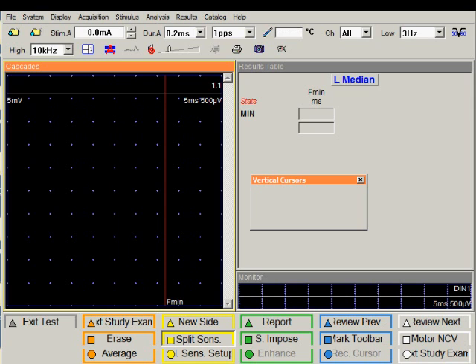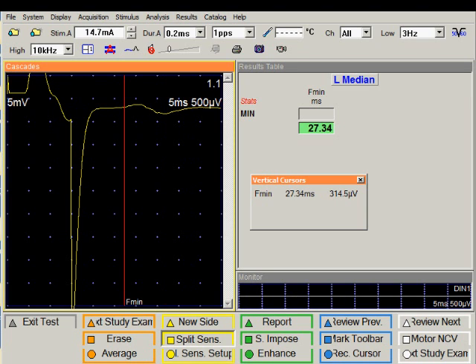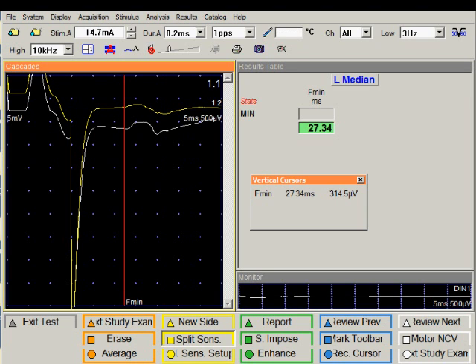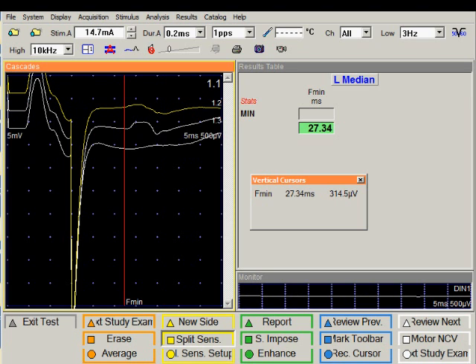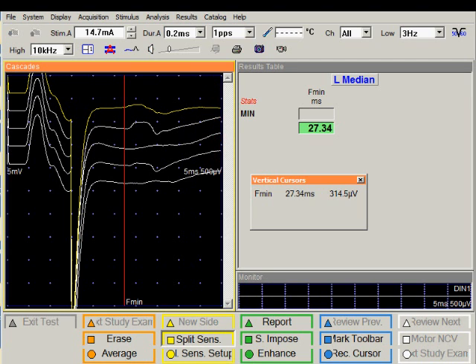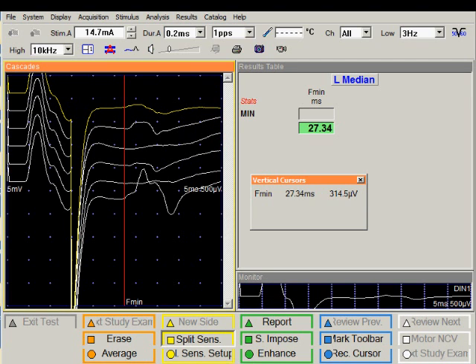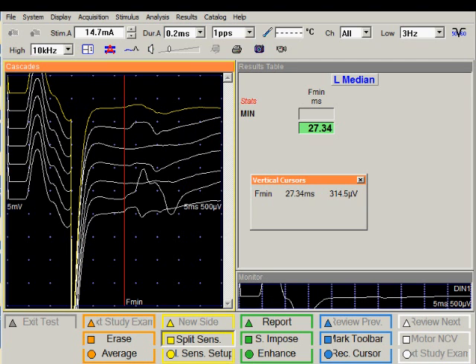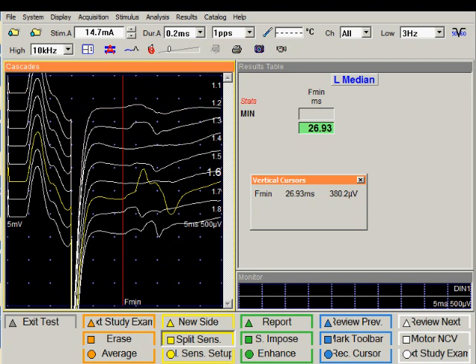We will now perform the F wave study. The F waves are marked automatically. I can go to the next exam in this study.